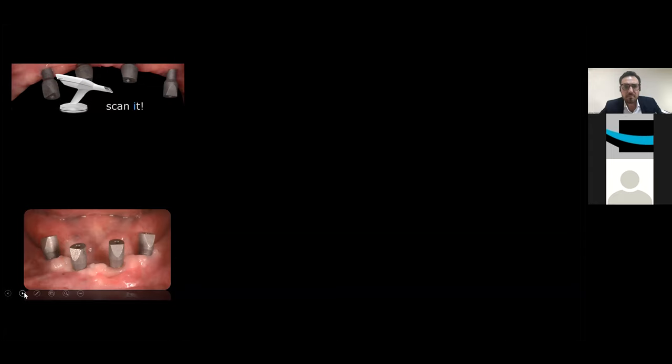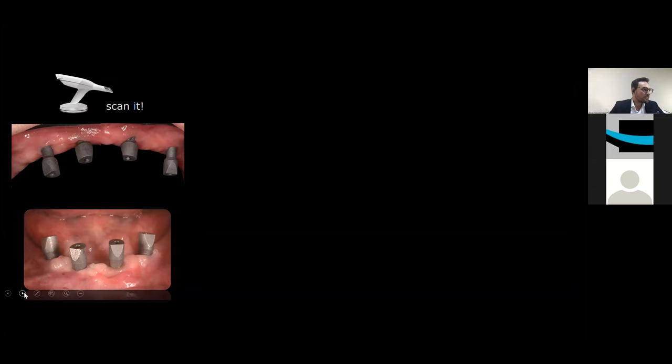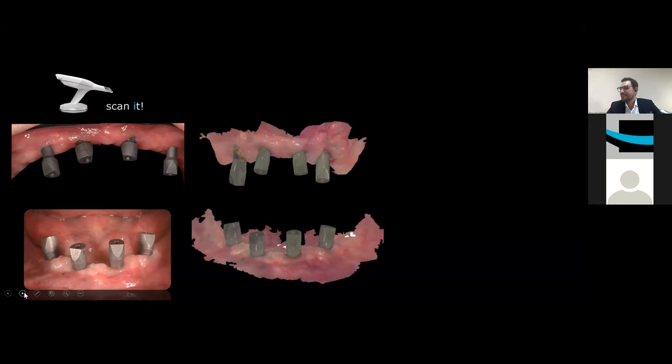After the healing of the tissue, I can take the digital impression of my implants. I believe in this technique. If you have some particular situation, you can take digital impressions on scan abutments, because we now have a lot of publications about this technique. So I don't have fear to get a good impression of my patient. Yes, sometimes you can have some problems, but I think you can control this during your daily practice.